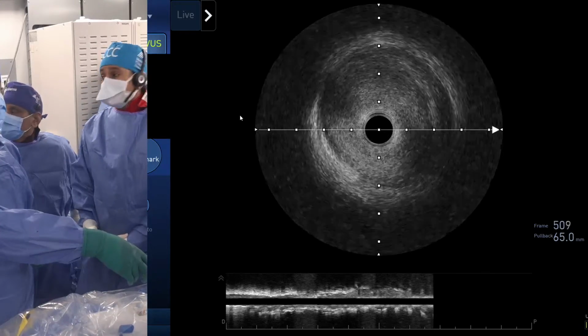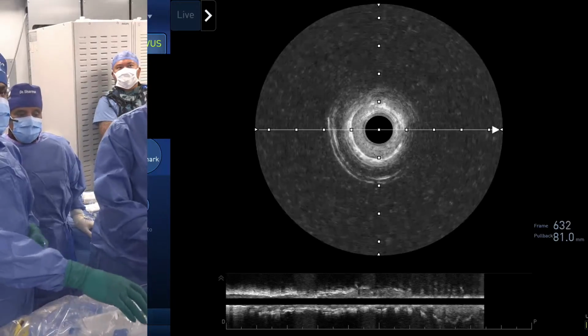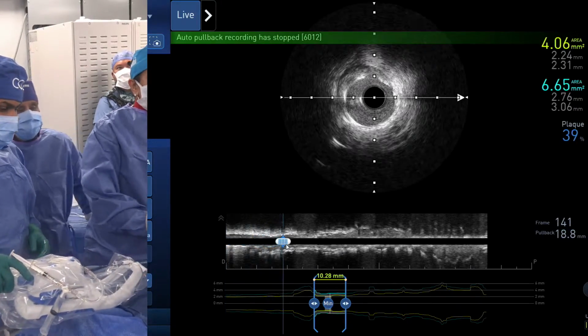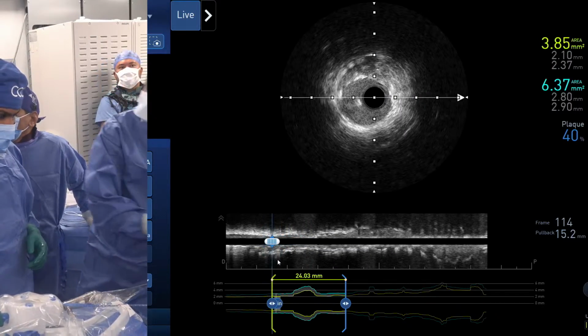Yeah, I can check the area because this is a small vessel. I think expansion is okay. Actually, by outlook it looks okay. Even dissection, I don't see much. Although, how far the catheter went down, I didn't go down because I just stopped at the distal edge.